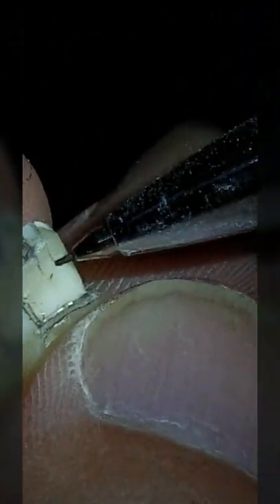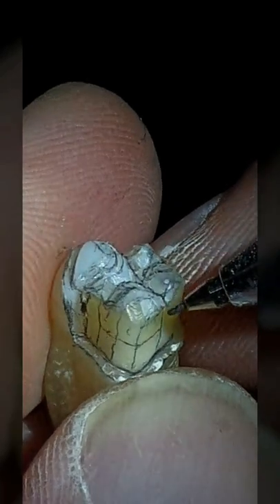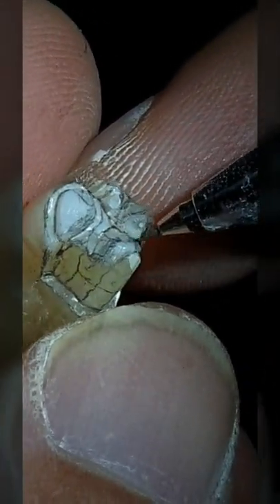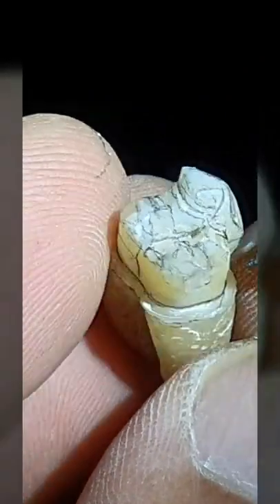On here as well, you should have 3 aspects, and each one would have separate areas. So 1, 2, 3, 4, 5, 6. Then you have 7, 8, 9, 10, 11, 12, 13, 14. 14 each, times 4 at least on each cusp and each wall. That's how you come along.